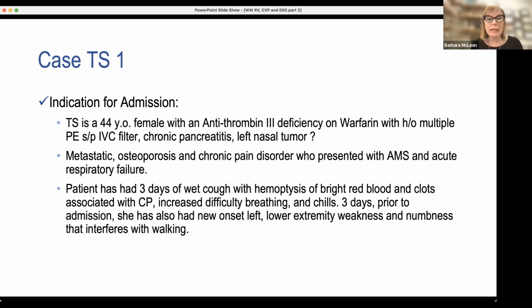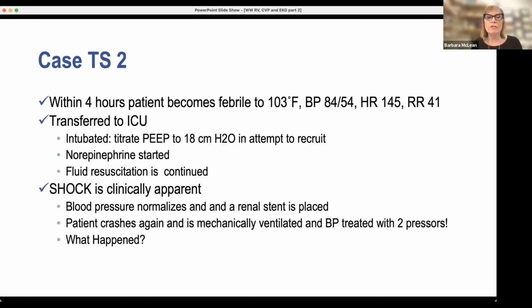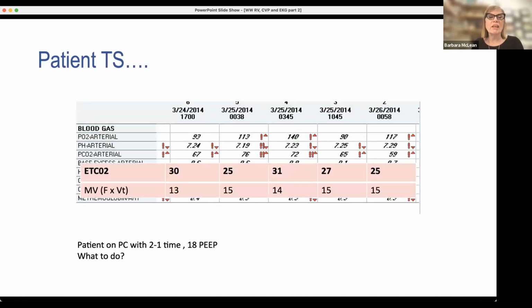But what I want to say is, I'm just going to move slightly through this, a fantastic patient that we had in our medical ICU quite a long time ago. I just want to remind you that you should always suspect RV dysfunction when your arterial-based cardiac output is low despite intervention: vasopressors, volume, inotrope. If you have a PA catheter and an arterial line and you're looking at the measure of stroke volume and cardiac output, there'll be a wide differential. When you have RV dysfunction, your PA measures may be very high, your arterial measures may be low.